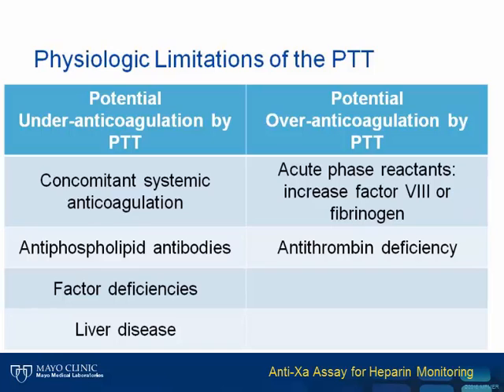Pre-analytical variables can also play a role in the variable heparin PTT response. The variable laboratory response to heparin therapy is primarily reagent dependent, but may also be instrument and procedure dependent. Additionally, erroneous baseline PTTs may result from improper blood collection, leading to prematurely activated samples and underfilled tubes, resulting in relatively higher concentrations of sodium citrate in the collection tube.